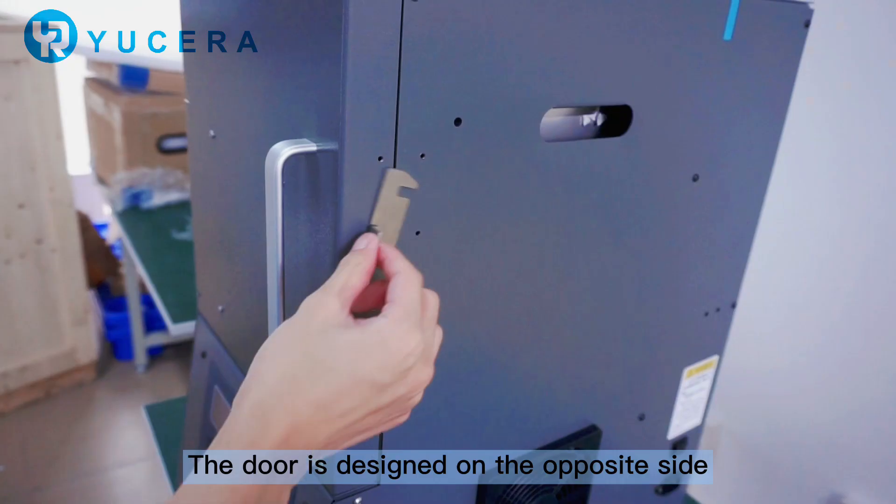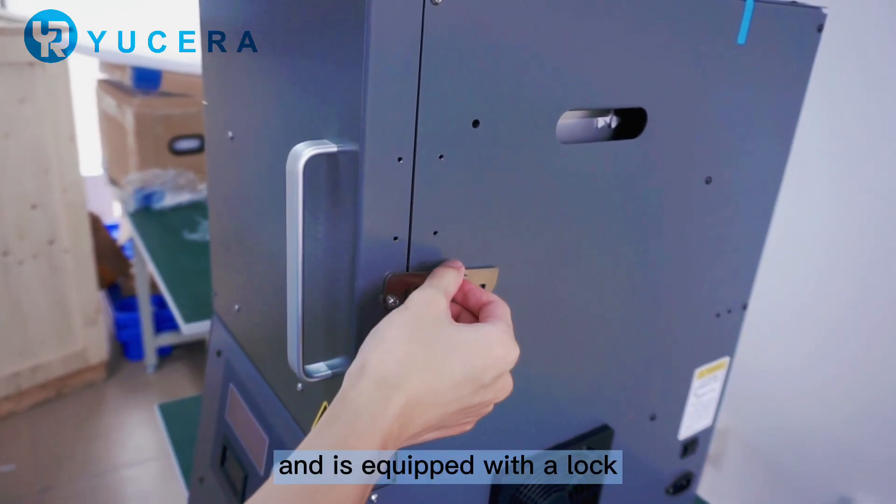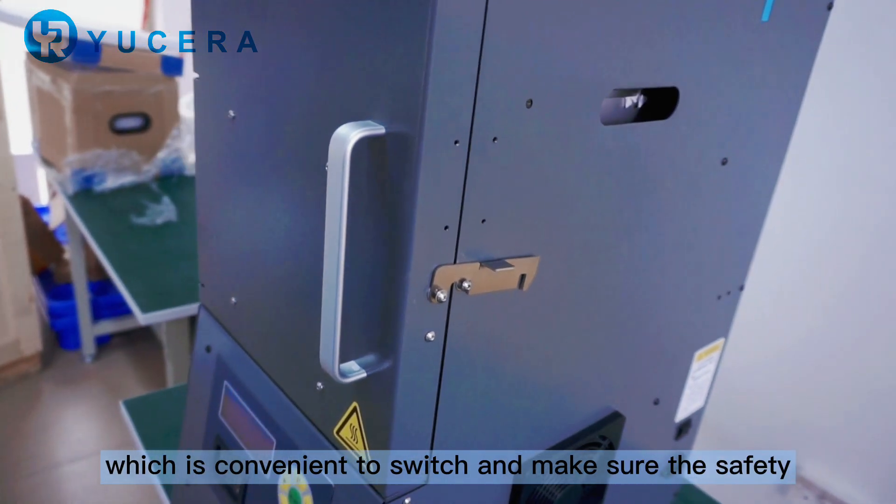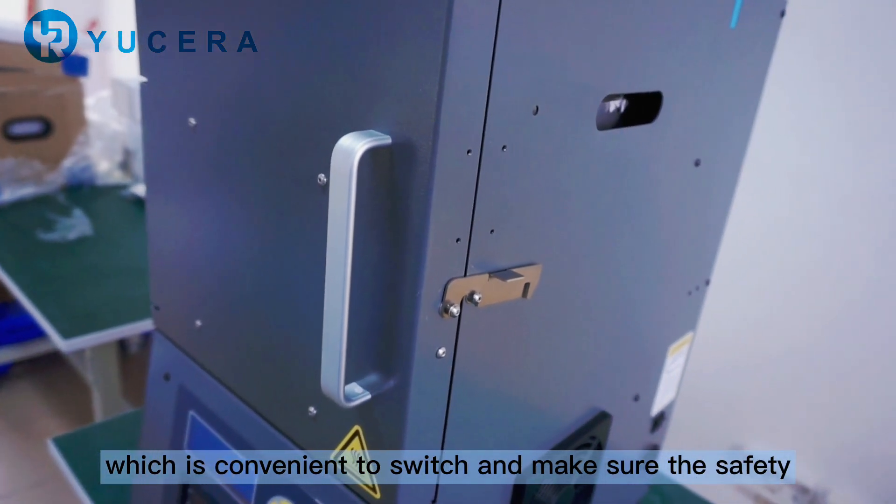The door is designed on the opposite side and is equipped with a lock which is convenient to switch and make sure the safety.